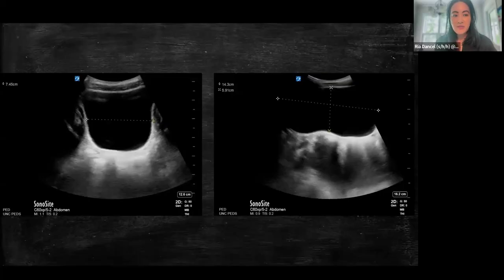I think for those of us that are med-peds, you think, okay, bladder volume of 300-something doesn't sound as bad, but he really shouldn't have more than 210 in his bladder. So we're kind of scratching our heads.